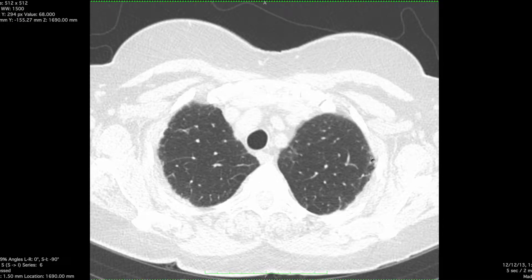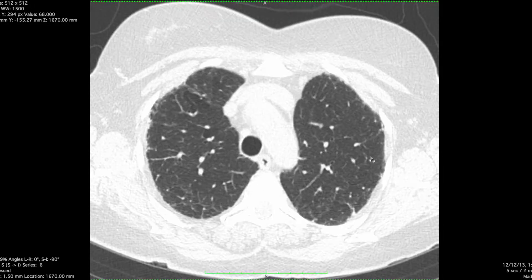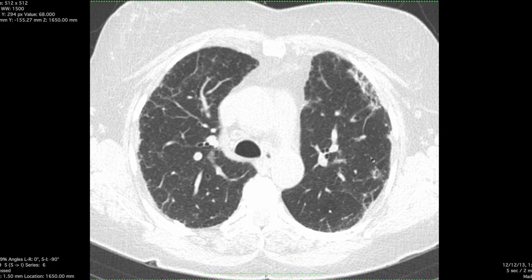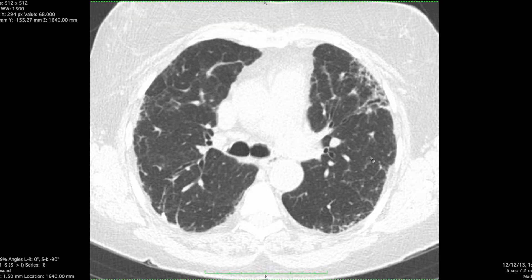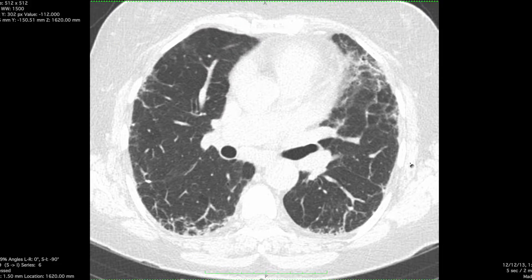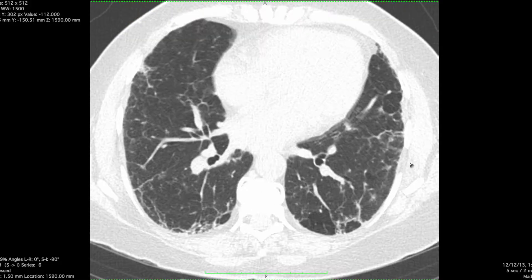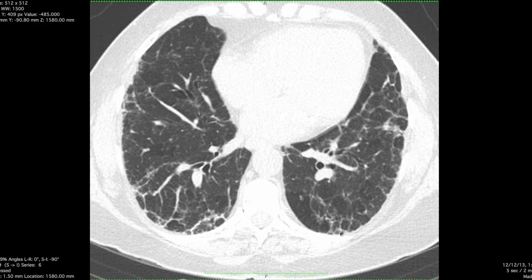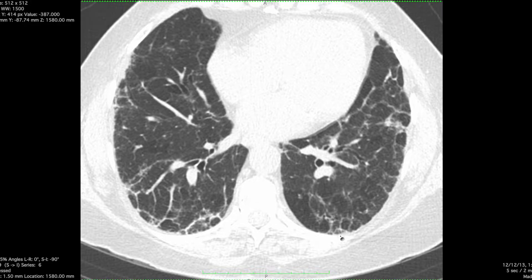We have another ILD case here. Here are the HRCT images. As we scroll through slowly, you'll see that there is peripheral and basal predominant pulmonary fibrosis characterized by reticulation, some mild traction bronchiectasis changes, and small little cysts in the lung periphery.